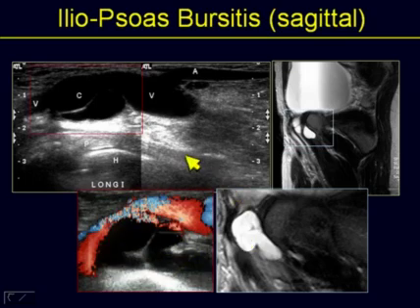So one more time, in the long axis view, you can identify immediately the femoral head against the acetabulum. And initially, when you put your probe down, you'll notice that it's very difficult to delineate what's going to be the sac or bursitis, the cystic appearance, against what's going to be great vessels. Many of us, of course, are very familiar with the pulsatile nature of the great vessels and probably can appreciate it on gray scale. But it's not until you put a Doppler angiography that definitely now you could see that it is the great vessel that is draped over this large and monumental iliopsoas bursitis.